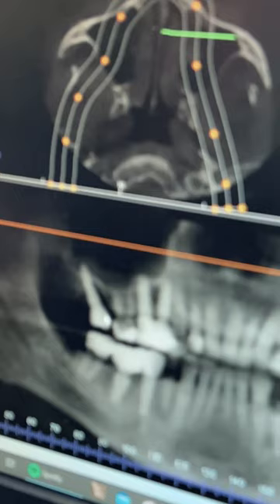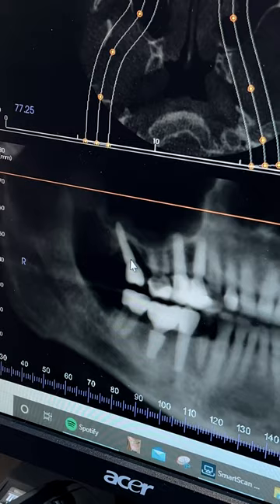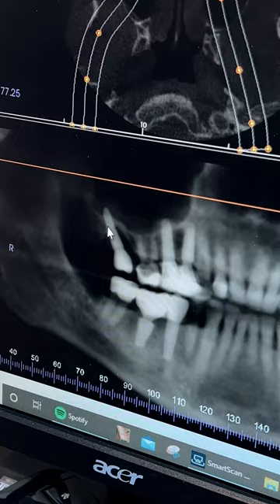Unlike the implant on the top, which was placed somewhere else about five years ago at approximately the same time, that already has a lot of bone loss and crown failure — improper crown position — and there is no platform switch on this implant. This is massive bone loss. That implant is failing; it needs removal.